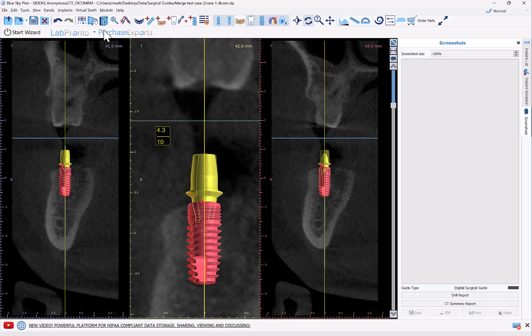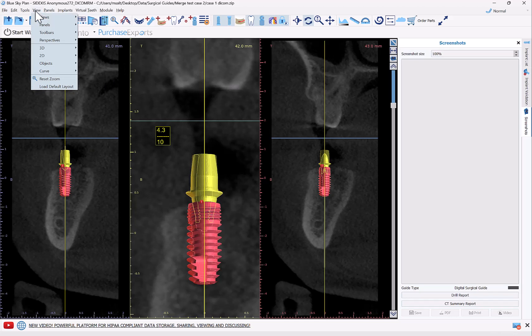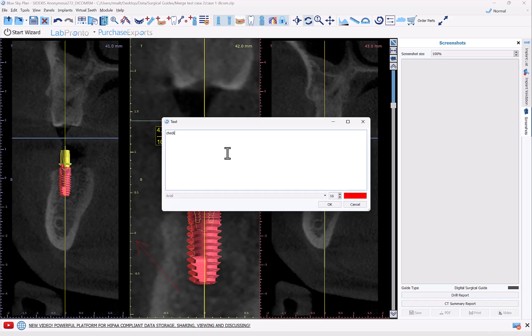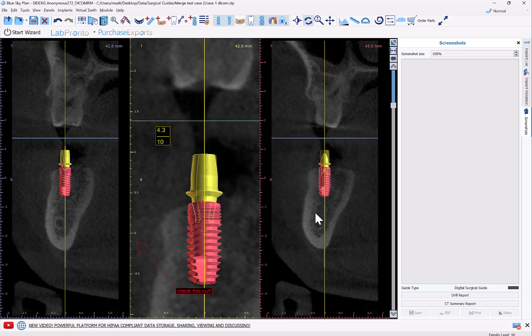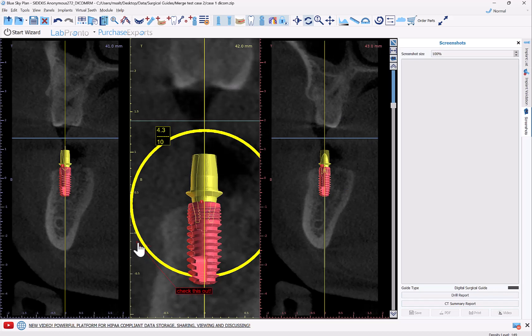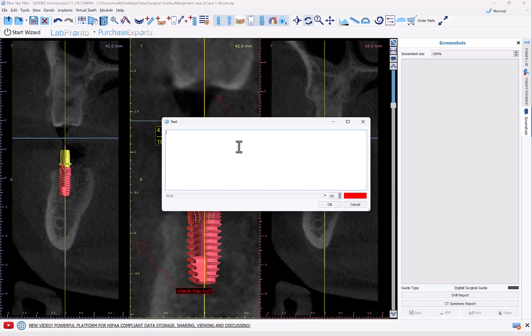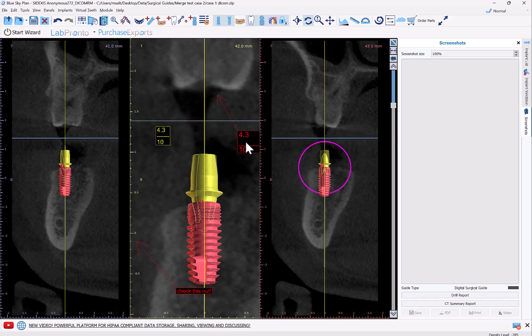To move the text, just grab it and drag it. In addition, you can use other tools — for example, add a marker to point out some particular anatomy, then click OK. Now you have both the text and the arrow. You can apply that to the implant size, and you can make the annotation much larger before clicking OK.